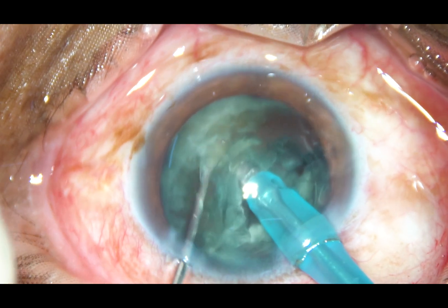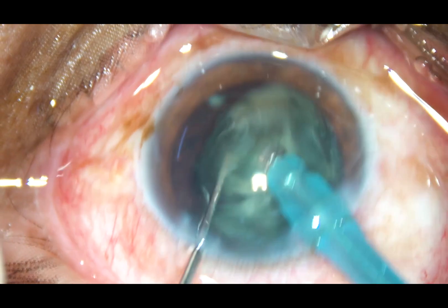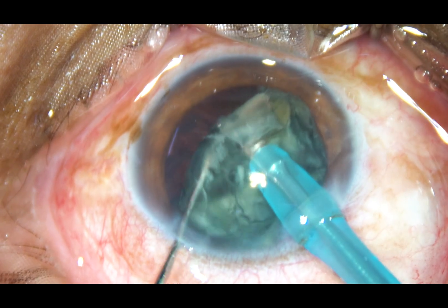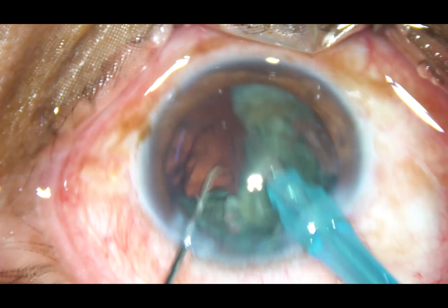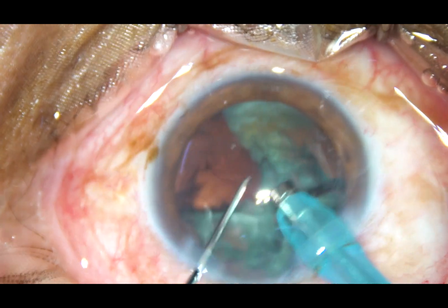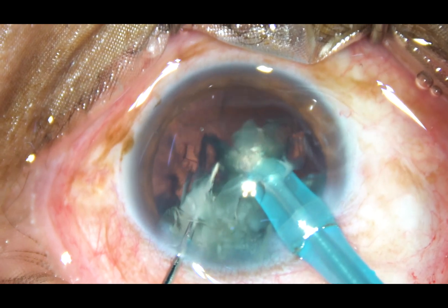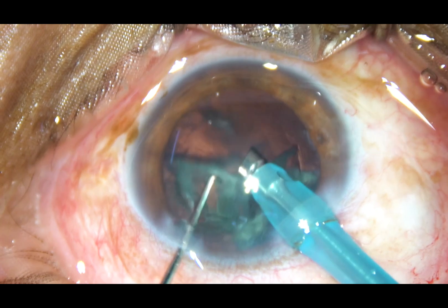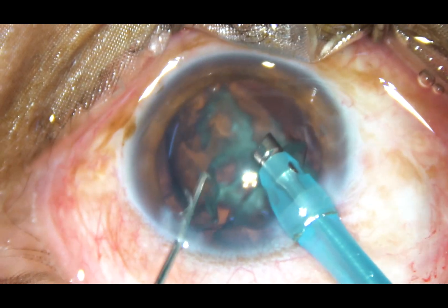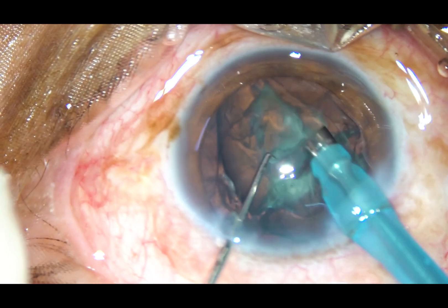This is the other hemi-nucleus. It is also chopped and now we have 4 fragments of the nucleus. Each nuclear fragment is emulsified with ultrasonic energy and removed. Ultrasonic energy used in this case is 60%, flow rate is 45 ml per minute, and vacuum is 450 mmHg.